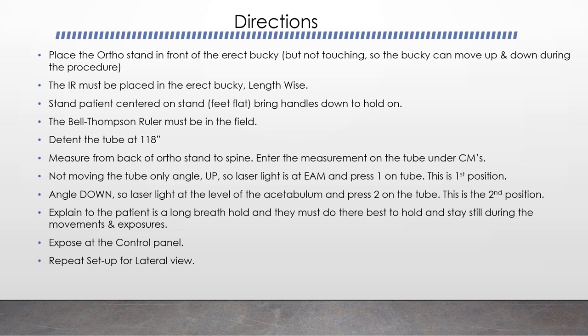Explain to the patient it is a long breath hold, and I mean long, and they must do their best to hold still and stay still during the movements and the exposures. Expose at the control panel. Repeat setup for the lateral view.